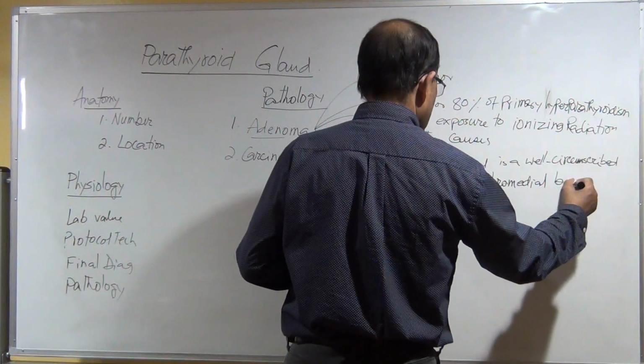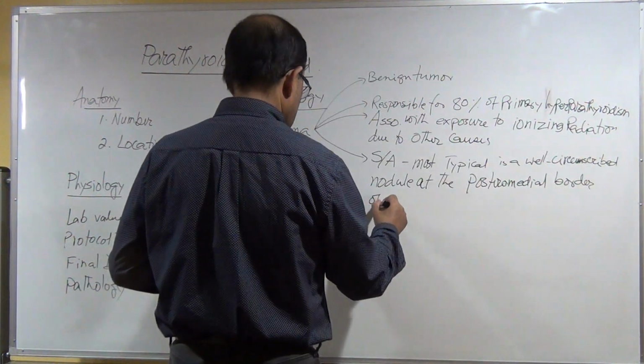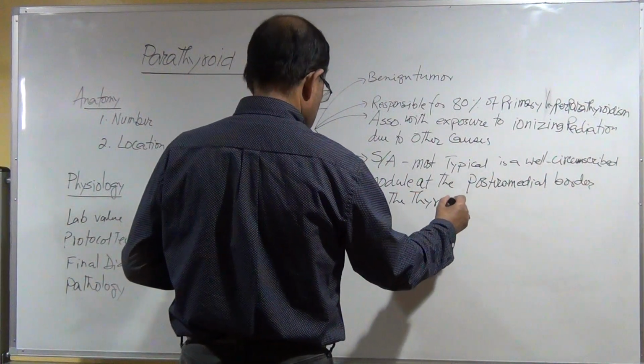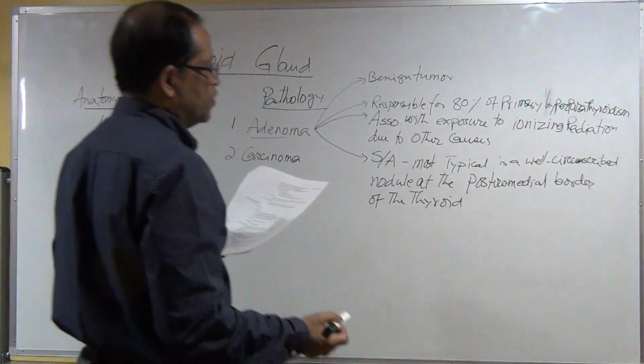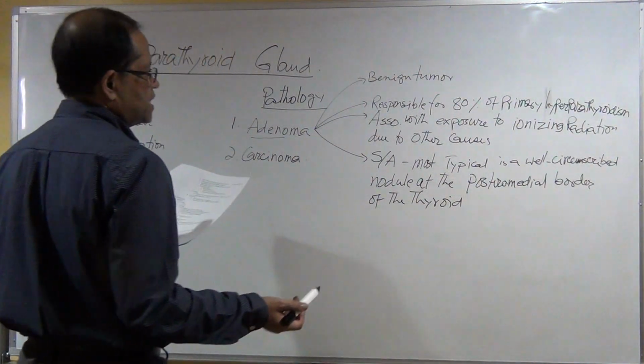That I drew before and I explained, I showed you and I discussed about it.